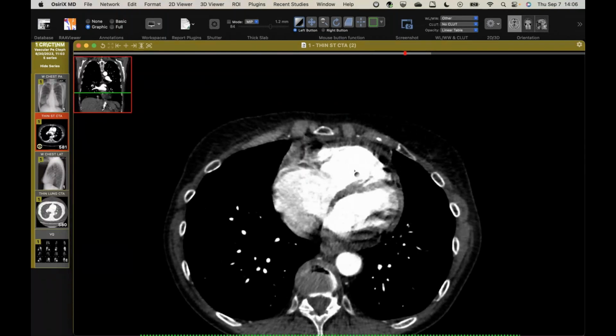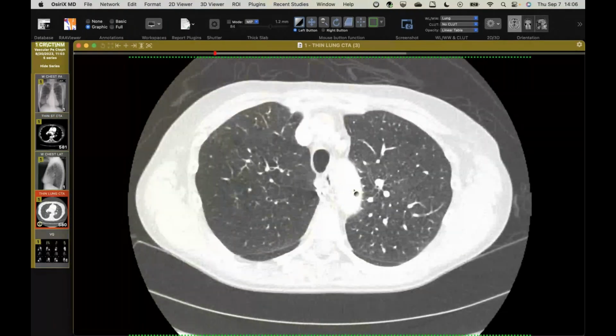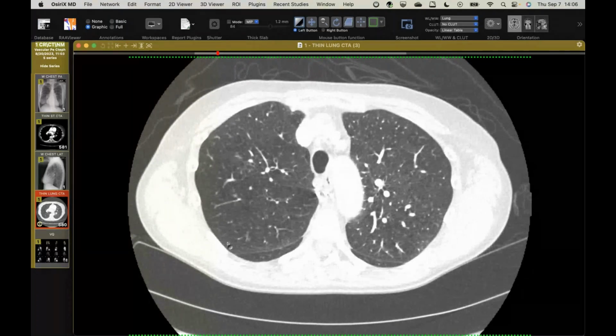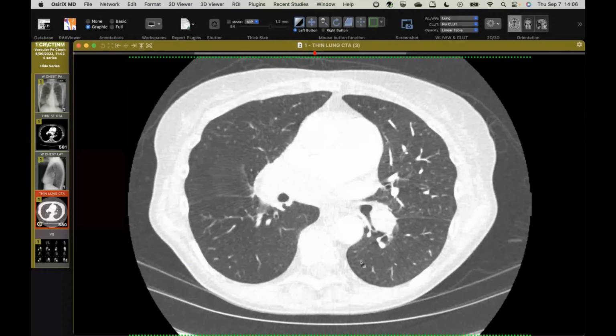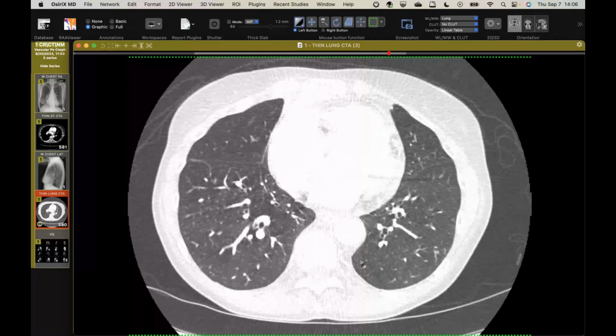And if we look at the lung parenchyma, there's a nice example of mosaic attenuation. Now, she does have some emphysema, but it's fairly mild, and you'll notice the vessels in the right upper lobe are small with what we saw in the radiograph here. So there are these areas of decreased attenuation, see anteriorly there in the left upper lobe, and then even down in the lower lobes a little bit in the middle lobe. You can see there's just subtle areas of decreased attenuation.